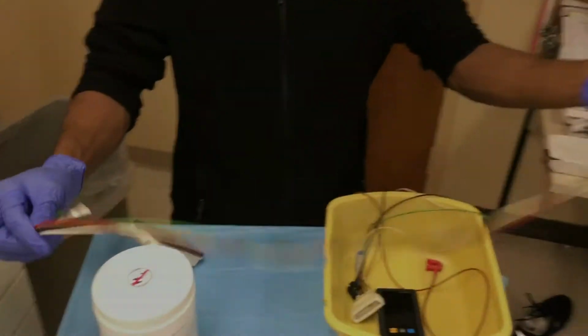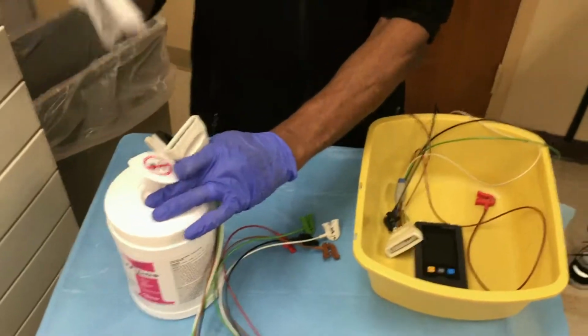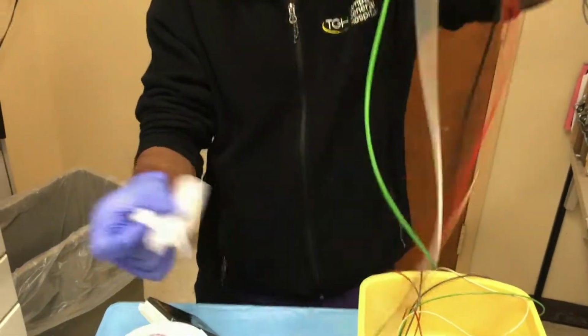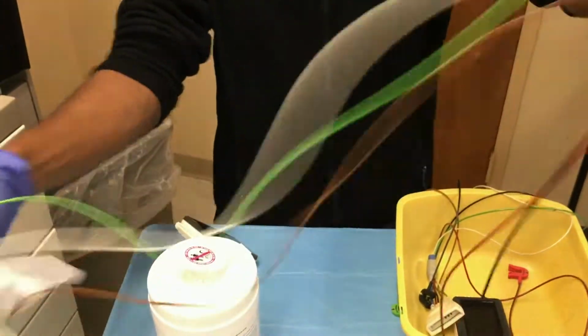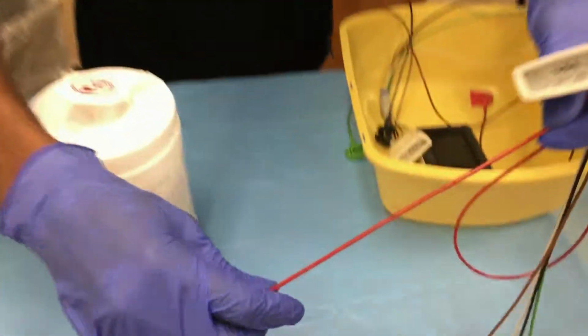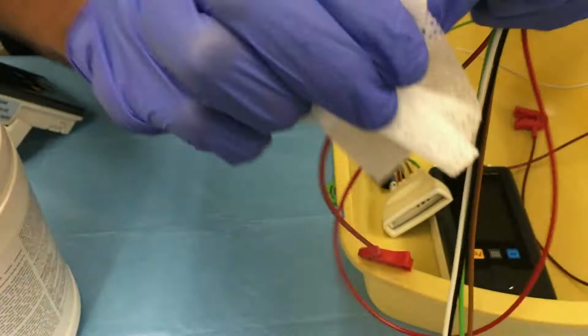This video will demonstrate how to properly clean the telemetry cords, also known as the leads or lead set. First, you want to make sure the cords are untangled. Then take one Cavicide wipe and wipe down each individual cord away from your body. Pay close attention to any lingering residue or debris. Notice how this particular cord has some residue still remaining on the cord.